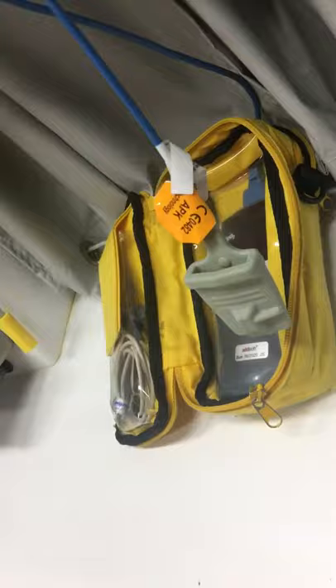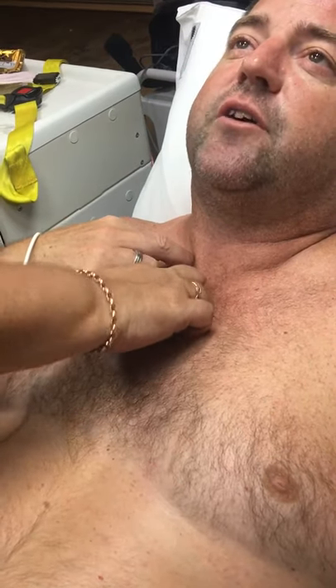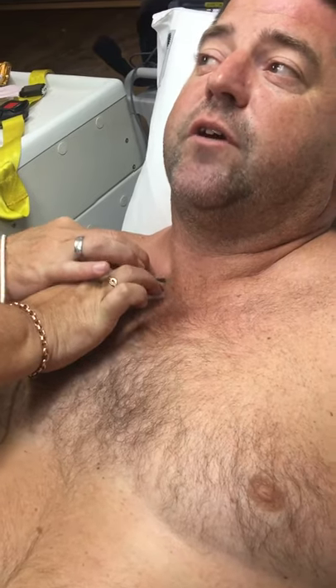ECG time. Now, ECG dots. Normally speaking you would shave my chest because it won't work so well, but Shel's going to have a little bit of fun putting them on. We're going to start with V1. It goes in the fourth intercostal space on the right sternal border. Come down this side first. Feel my clavicle — go underneath it, you can feel the top of my rib. Go down one space — that's the first intercostal space. Keep working your way down the rib spaces. You'll have to press hard.